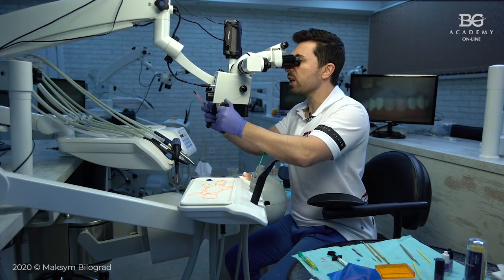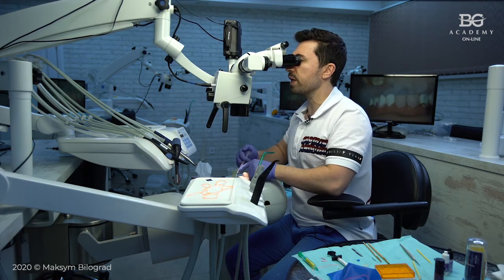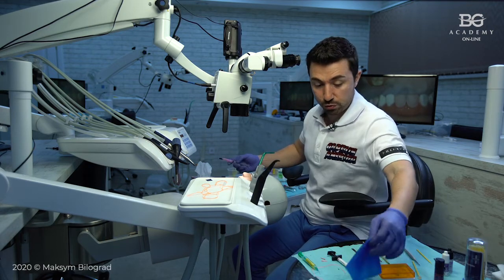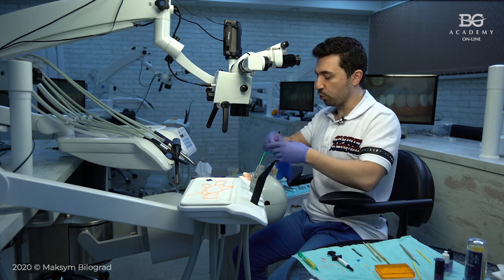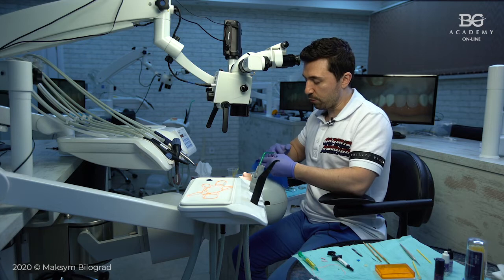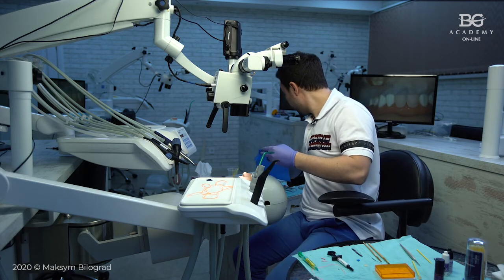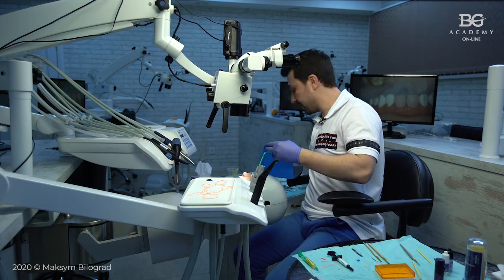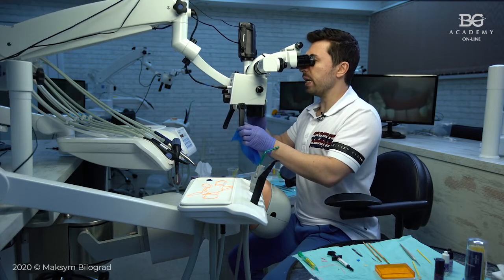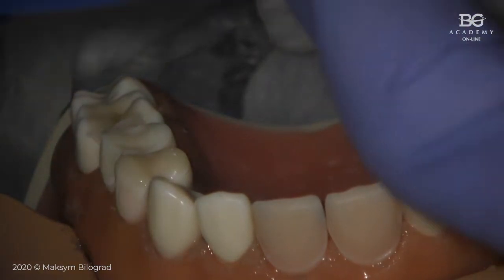Let me just continue. I will put some glycerin gel. I don't do this in the patient's mouth because the patient has saliva. My patient here doesn't have any saliva, so I have to help myself with a lubrication. So basically we use some glycerin here, but one more time, for a patient no need for that, because saliva helps you to do that isolation easily. Okay, let me move my patient this way just to be able to make proper rubber dam isolation.